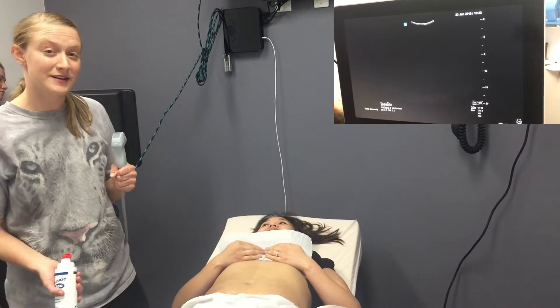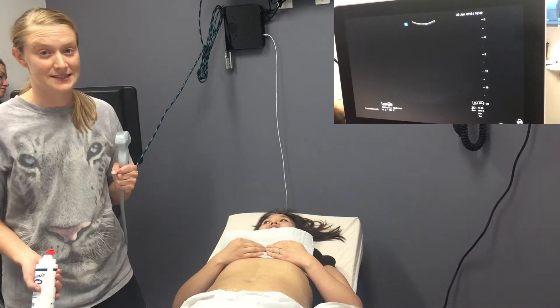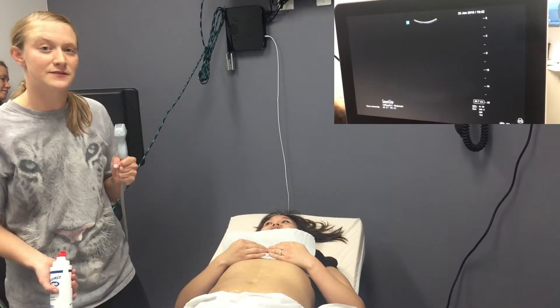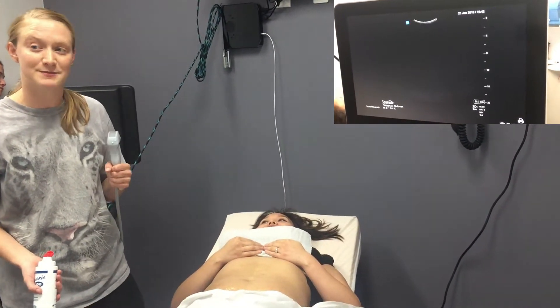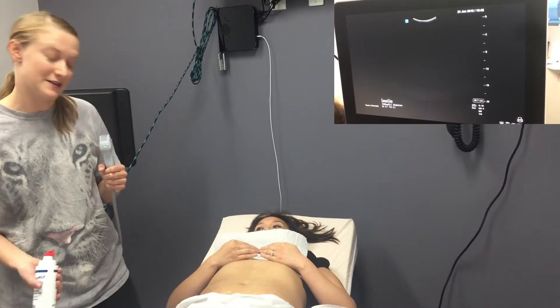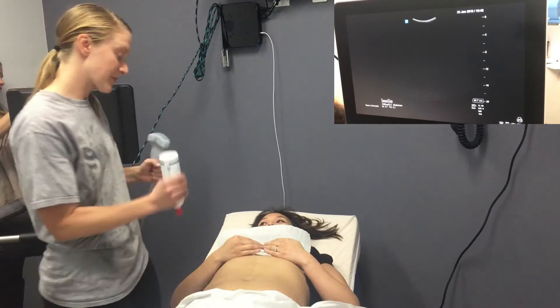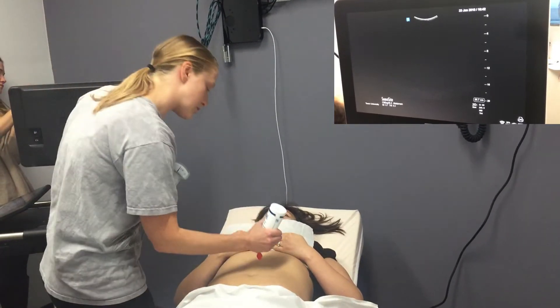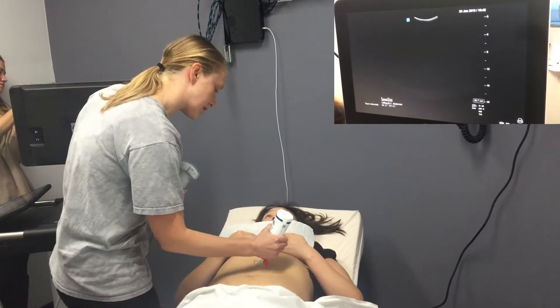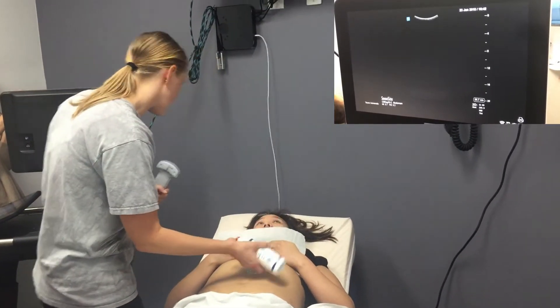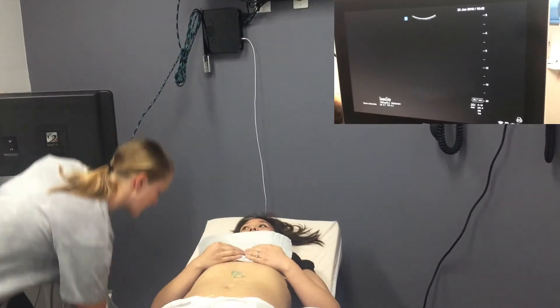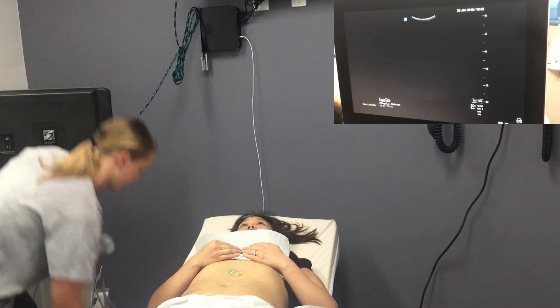Hello, today we're going to do a FAST exam, which means Focused Assessment with Sonography and Trauma. We'll be focusing on looking for free fluid in several body areas.